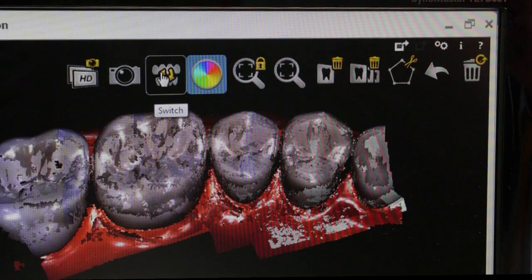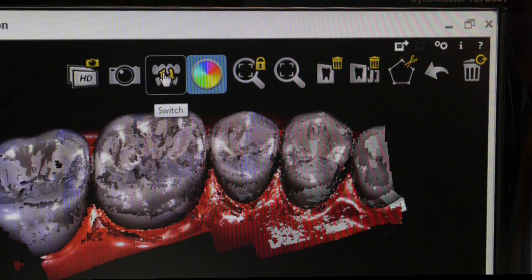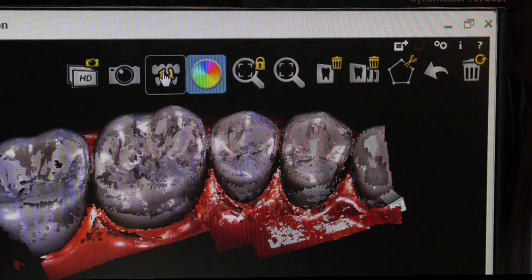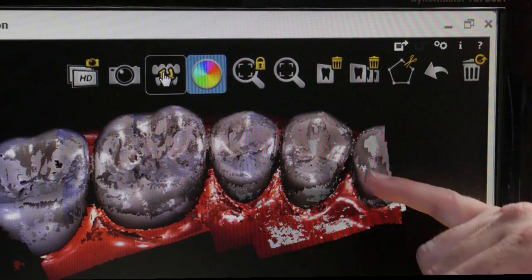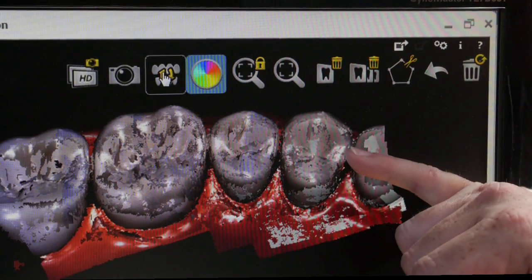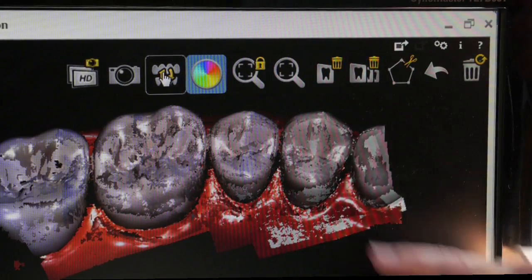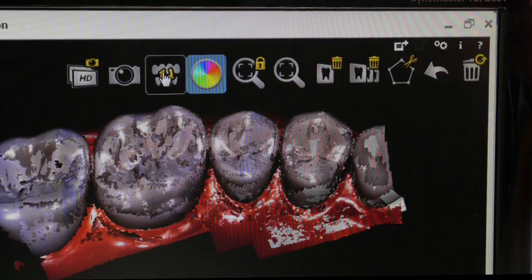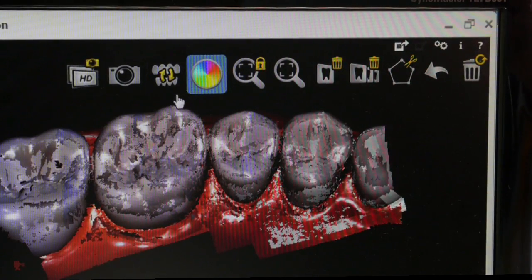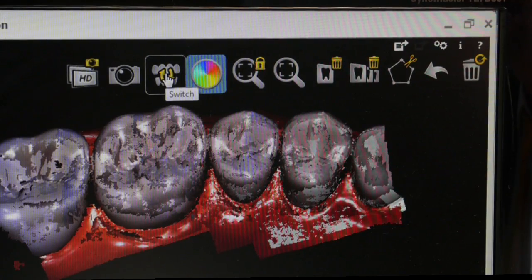This icon allows you to switch JAWS. What that means is if you've scanned, as you can see this upper quadrant here, but the computer thinks that that was the lower, you can swap the arches around by clicking on this button.